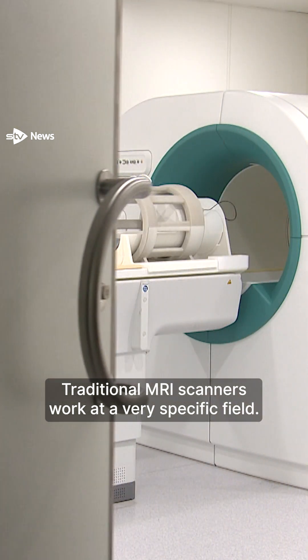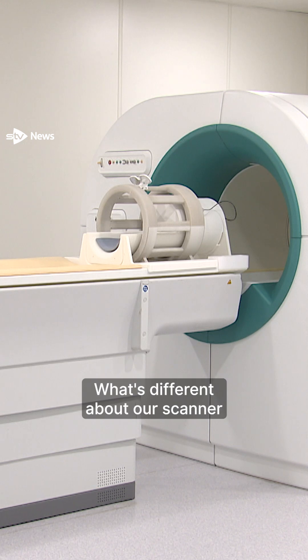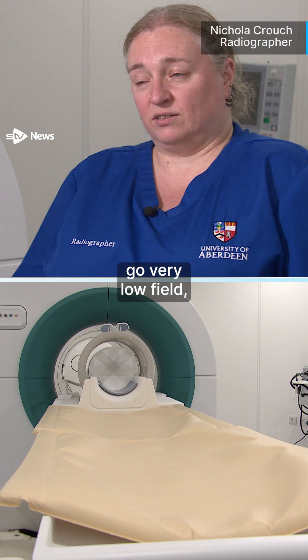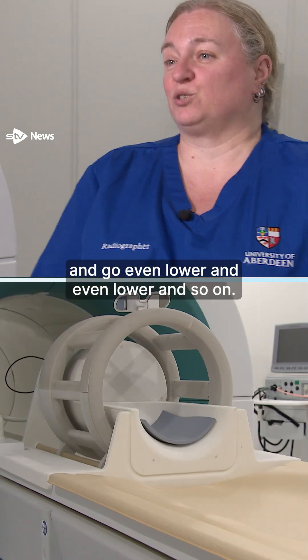Traditional MRI scanners work at a very specific field. What's different about our scanner is that we go very low field, and then we can change our field and go even lower and even lower and so on.